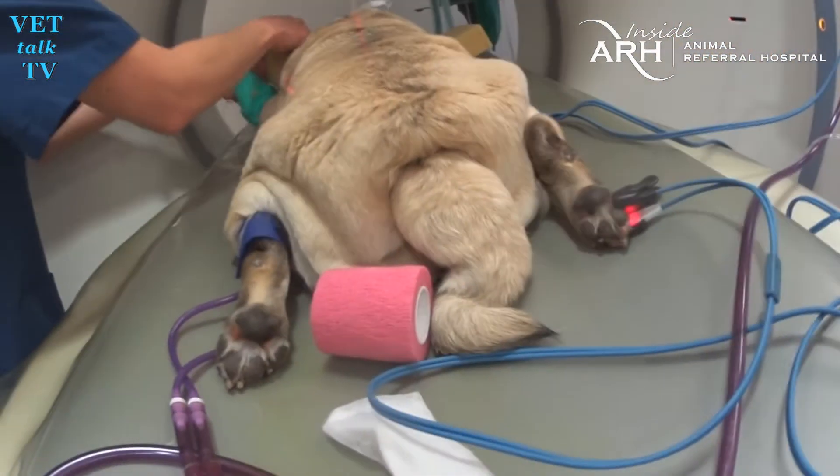So, how does it work? The best way to describe a CT scanner is if you imagine the body as a loaf of bread, and when you look at that loaf of bread, all you can see is the outside. But if you slice the loaf of bread up into individual slices, you can pull out each individual slice and examine them. So essentially, the CT scanner is the same — it examines the body in individual slices, allowing us to pull individual slices out and look for disease and any bony fractures that may have occurred in the patient.